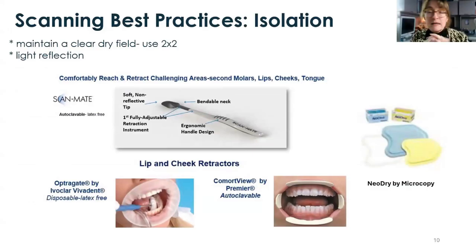Oh, I've got one last slide. Sorry. So one thing that Yen and I were talking about was how best do we begin that full arch scan, right? We're not talking about crown preps. We're talking about a new patient record scan.